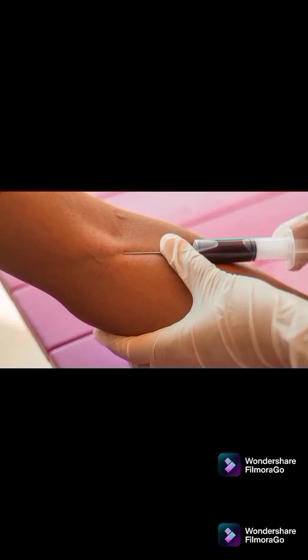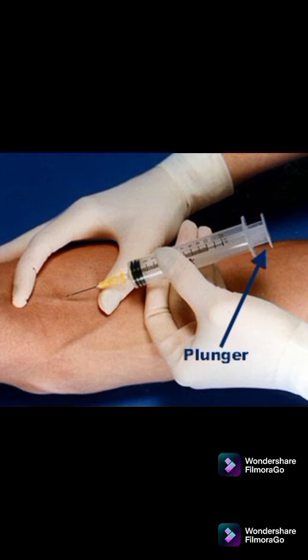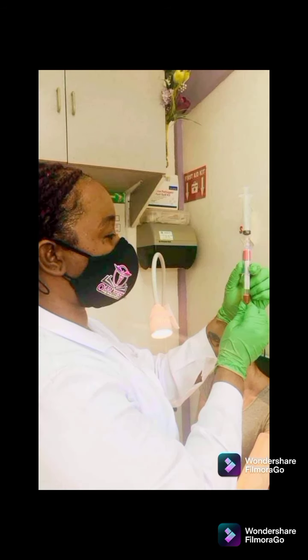The same steps should be followed when using a needle and syringe system. However, release air from the syringe before penetrating the vein, and blood is filled into the syringe by slowly pulling back on the plunger. Remove needle and discard. Then attach a transfer device to the syringe for filling the tubes.